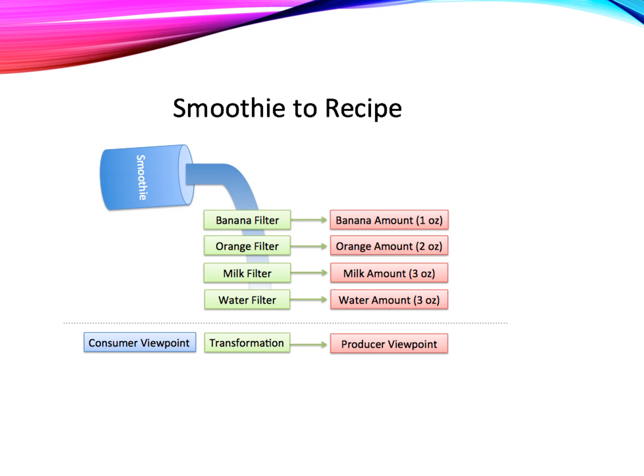Another way to think of the fast Fourier transform is that it almost takes the recipe that all those red blood cells are putting out there and figures it out and gives us what we perceive to be our spectral tracing. So say this group of blood cells is sending back to the transducer this sort of waveform.